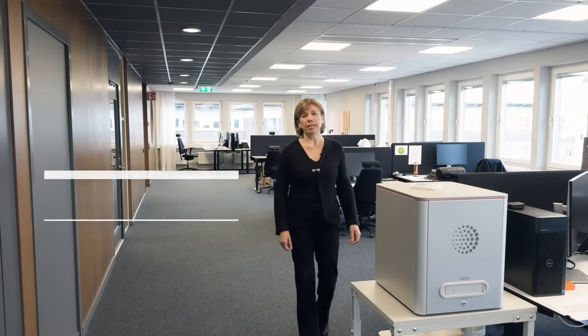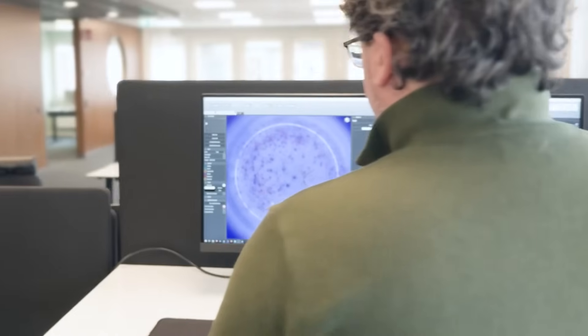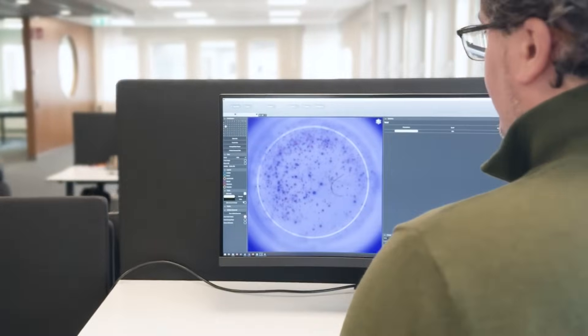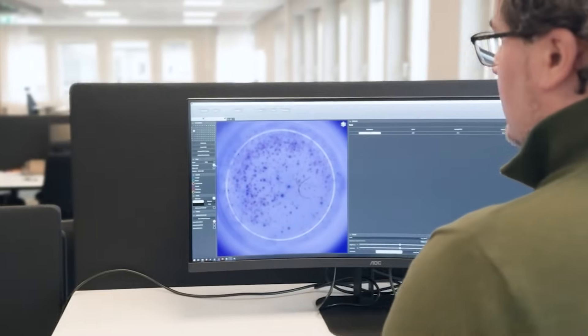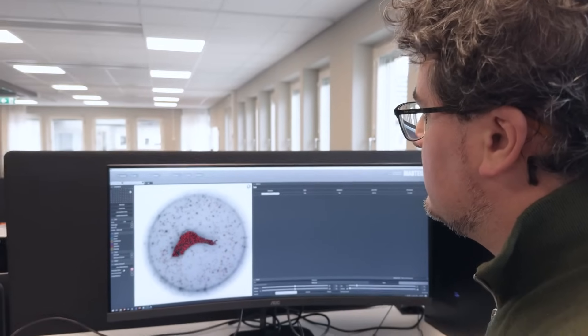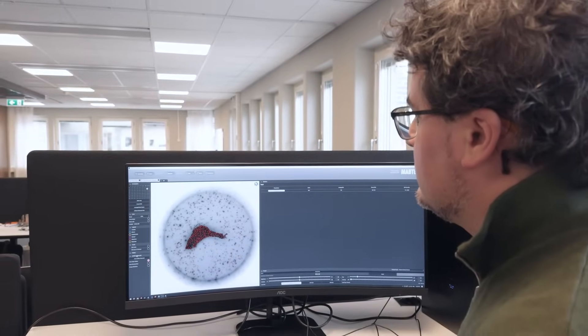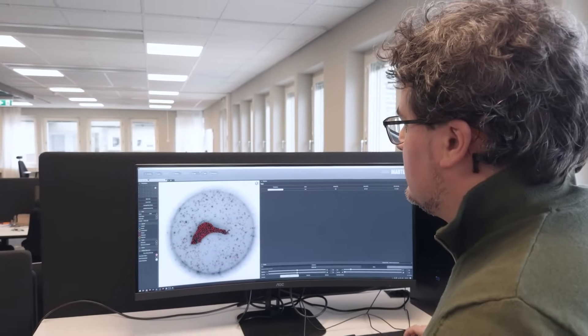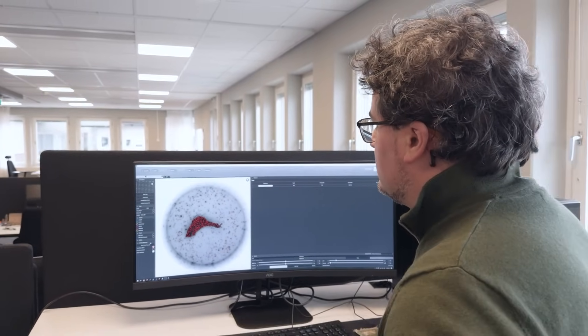To address this challenge, Camcom developed an automatic tool that seamlessly integrates with Mabtec's APEX software to identify and mask artifacts. By leveraging artificial intelligence and medtech domain knowledge, this tool effectively distinguishes unwanted artifacts from genuine spots.